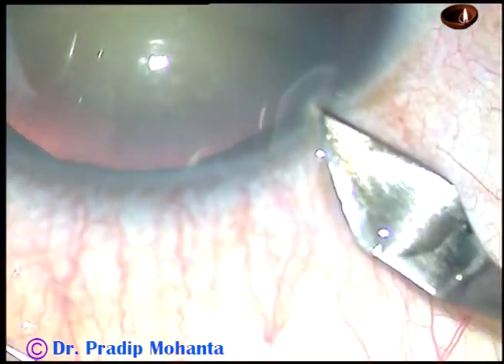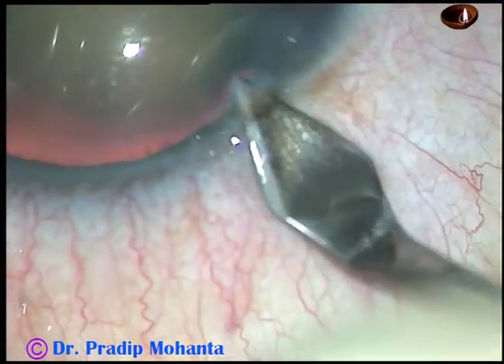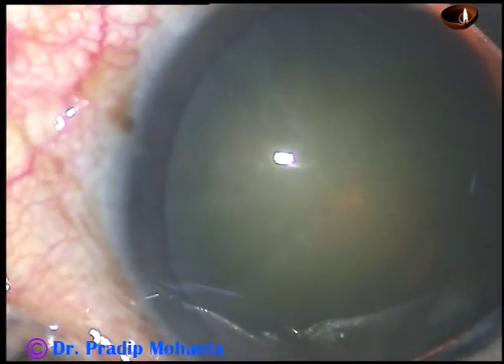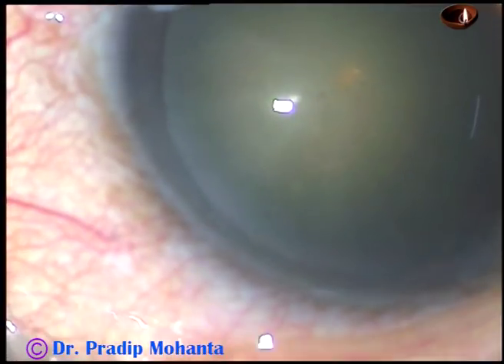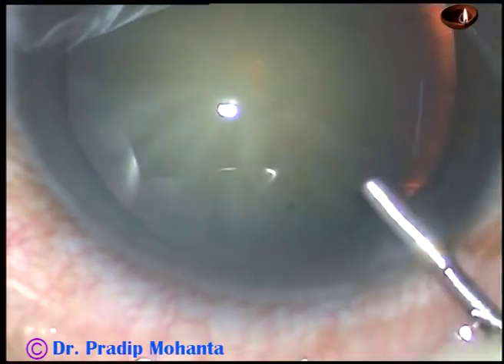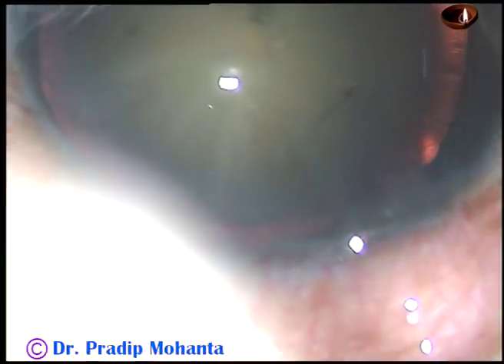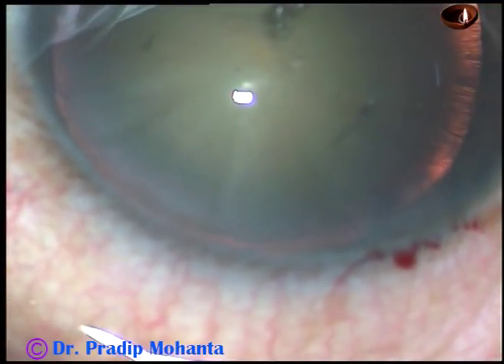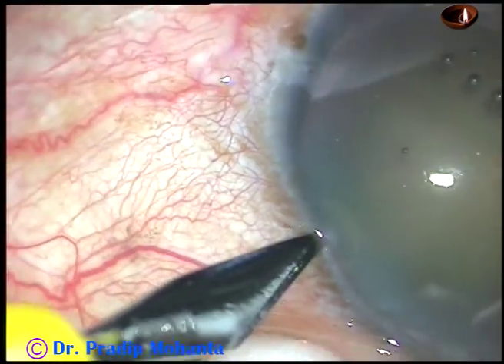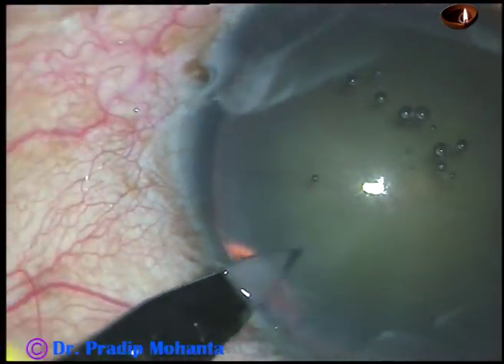This is the main incision on the posterior aspect of the limbus. This is a totally unedited recording at a little higher magnification where you can follow the nuclear management very clearly. After making the main incision, visco is used to fill the anterior chamber, and now this is a paracentesis on the left side of the main incision.